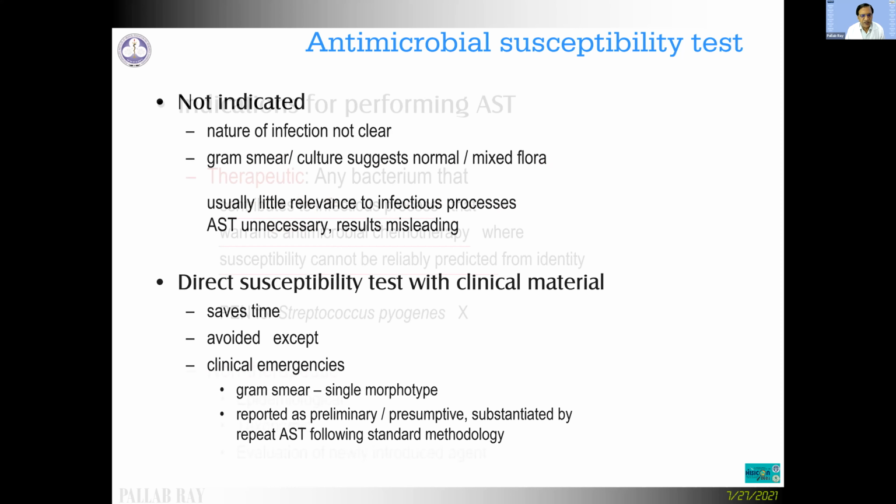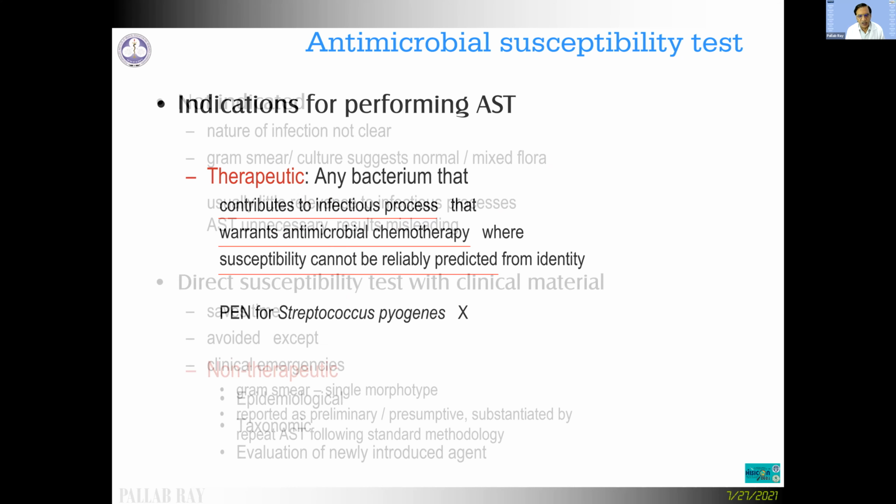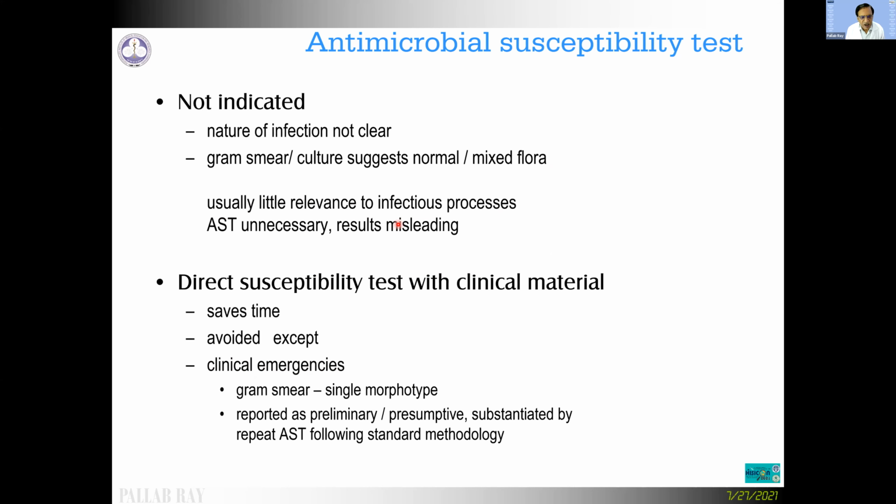Even in my previous slide, you see that I have started with any bacterium. So that means we always start with an isolate, but there are situations where one might think about direct susceptibility test with the clinical material because it saves one full day. It should ideally be avoided because whenever we are carrying out a direct susceptibility test, we are not sure whether in the specimen we do have a bacterium.